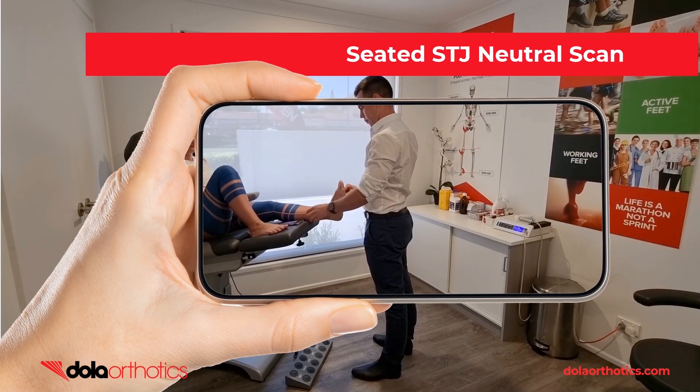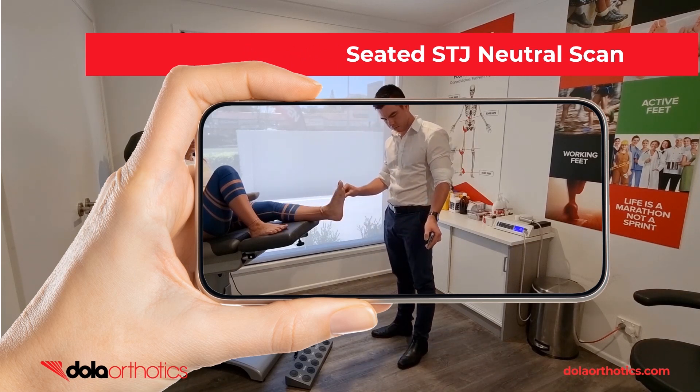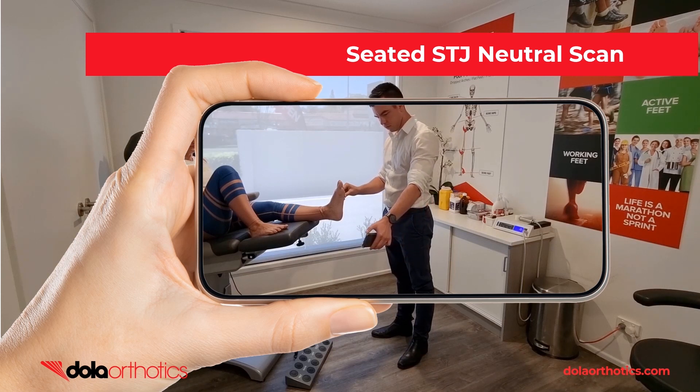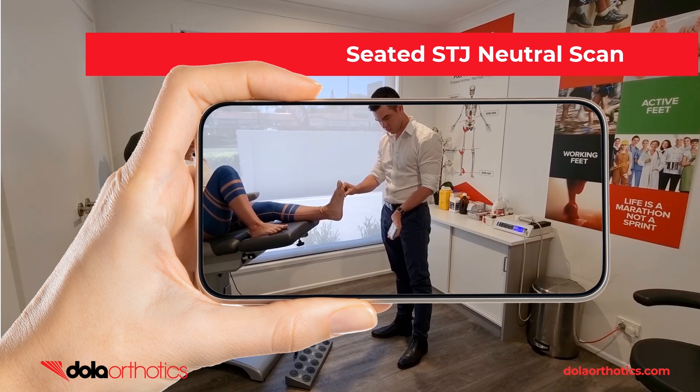Here is a demonstration of the iPhone being used to scan the foot with the patient in the seated position, most commonly seen in clinical health practices. The clinician is able to hold the foot in subtalar joint neutral just like completing a traditional supine plaster cast while completing the scan. Move the phone to capture all aspects of the foot including the heel and assess the scan prior to submission.